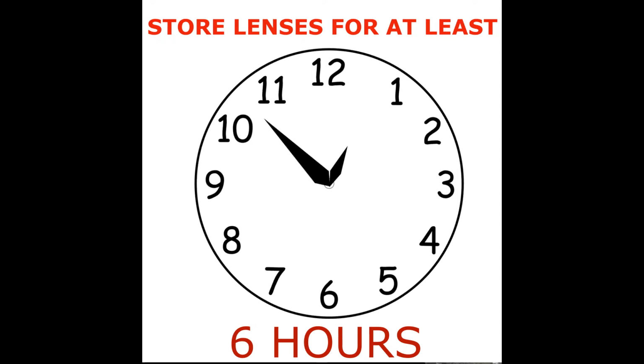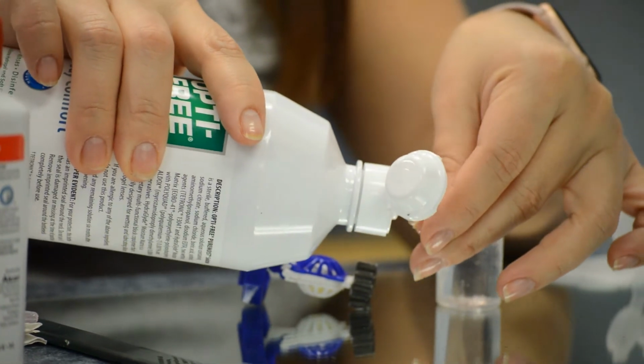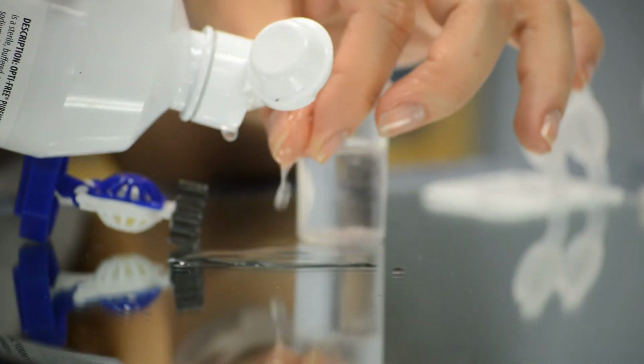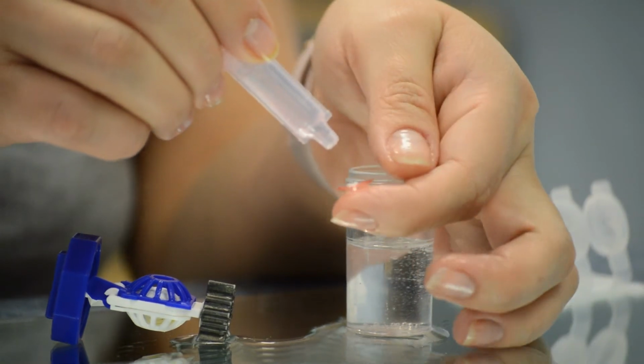Once the 6 hours are up, you may once again use your Ortho-K lenses. But to make sure you don't feel any burning or stinging, always rinse your lenses first with the multi-purpose solution recommended by your doctor. And don't forget to fill your lenses with the preservative-free solution recommended by your doctor before inserting your lenses once again.